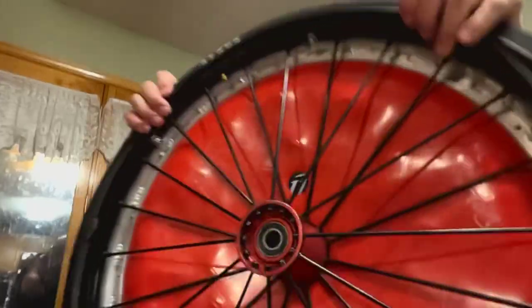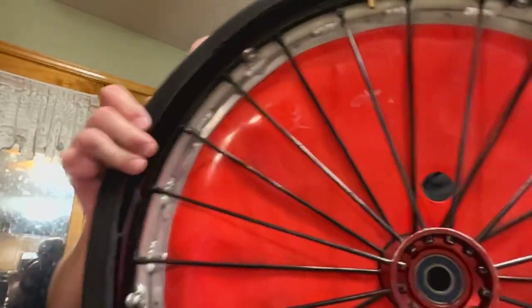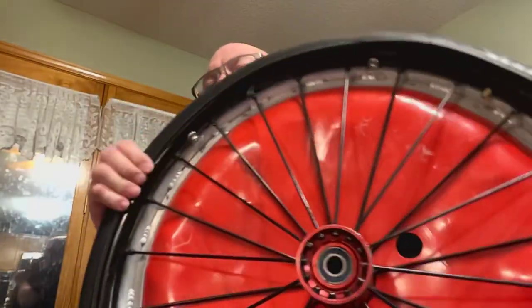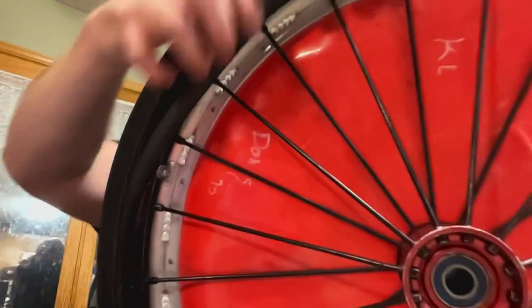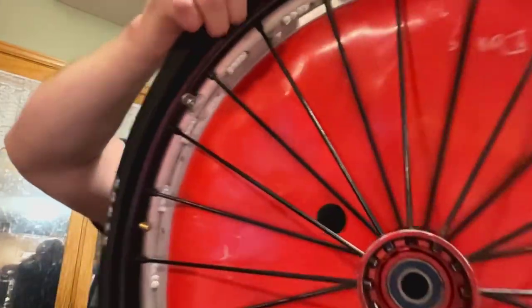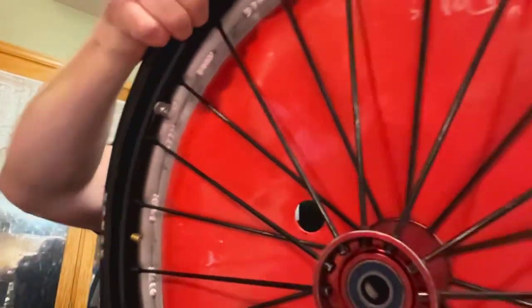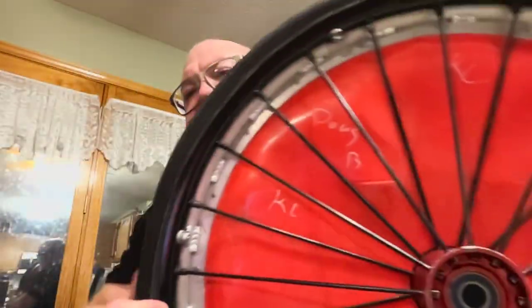Ooh, I really should use this more often. I can see what's going on. Basically, what I'm trying to do is get the tire back seated. That tube is sitting in there, and I want that tube to actually be pushed into the center rim, just a little bit. I want the tire to kind of sit over that tube. Everything should be flat against that rim.